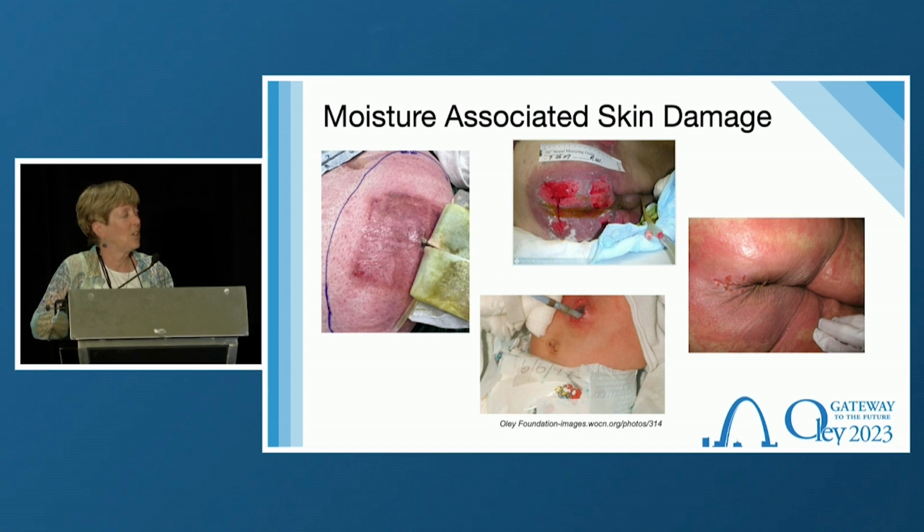And then this one on the far left was a patient that I saw a few weeks ago. We got called down to the ER, and he was sent home with a drain. He'd had some laparoscopic surgery and had a drainage tube, which patients sometimes have after surgery to pull the excess fluid out. He was sent home with an occlusive dressing on, some gauze and some Tegaderm, that clear adhesive, over it. He had been home for about a week, and it had started leaking a little bit around the tube, and nobody had instructed him to change the dressing, and I guess it didn't occur to him.